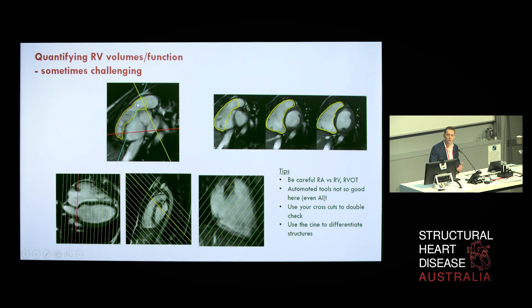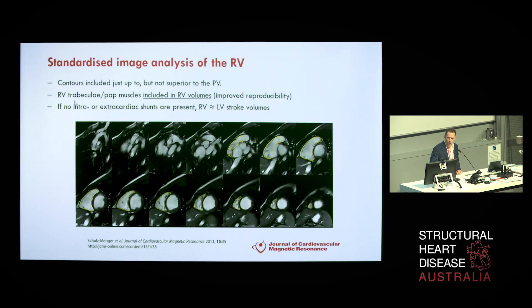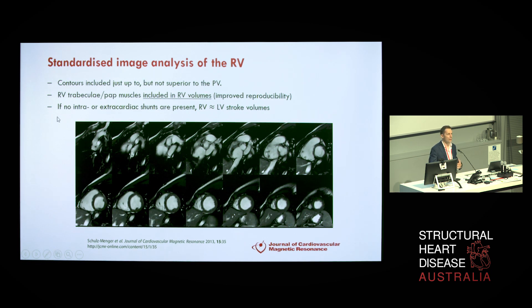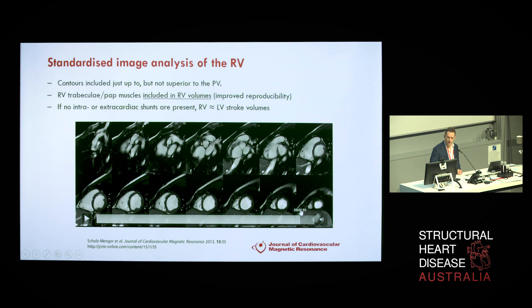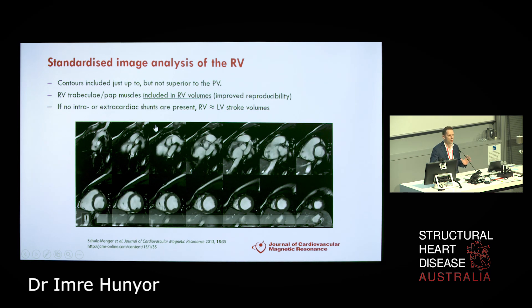This is critical in cases such as surgical planning and timing of intervention for patients with repaired tetralogy of Fallot where you're serially monitoring RV size and function. The convention is to include contours up to but not superior to the pulmonary valve, and trabeculae and papillary muscles are included in RV volumes for improved reproducibility. Assuming no intra- or extracardiac shunts, the right and left ventricular stroke volumes calculated from contours should be roughly equal, with minor differences due to bronchial arterial supply.